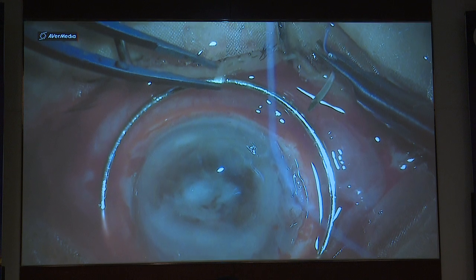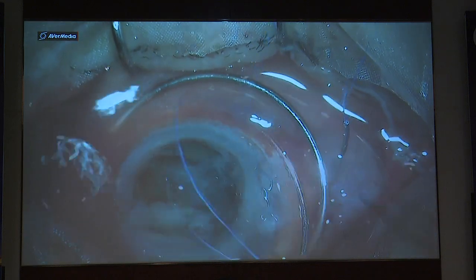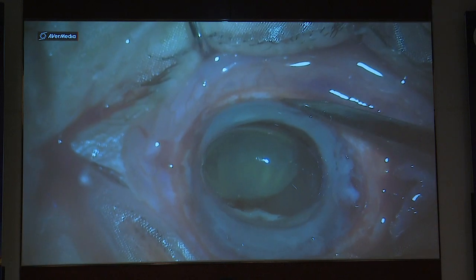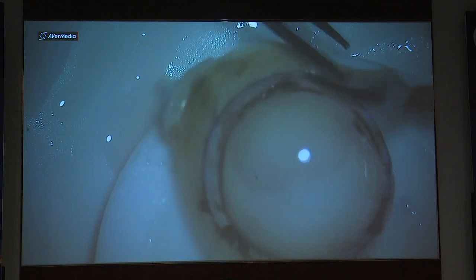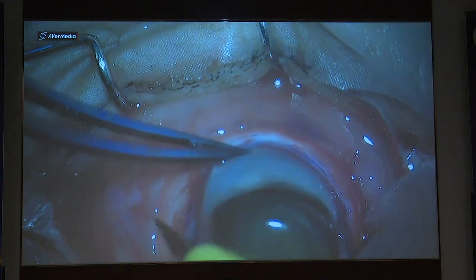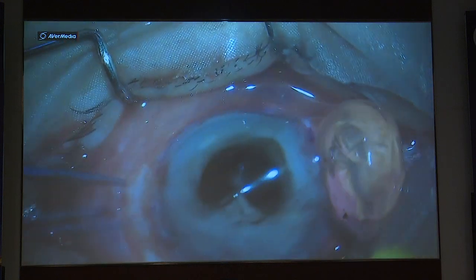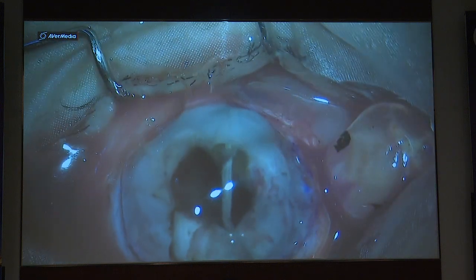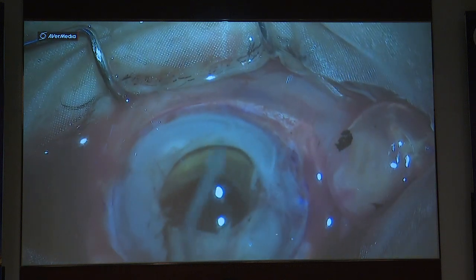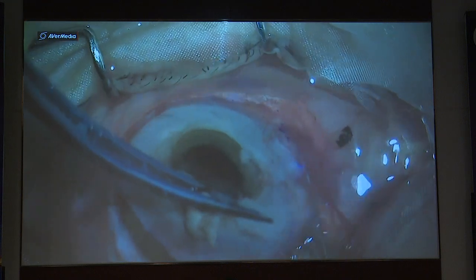Now sometimes there's a large corneal abscess which is almost perforated. Care needs to be taken here because, like in this case, first suture for the Flieringa ring and the lens is out. Now this is a sticky situation, so first I made the graft and then started dissecting the host. Tried to keep the lens at its place for as long as possible to avoid a longer duration of an open sky. Dissected the iris from the host.